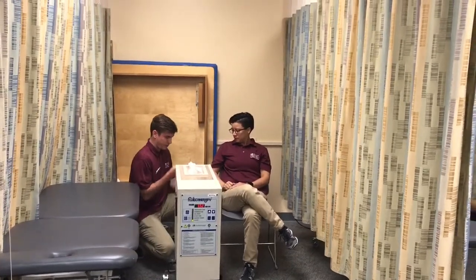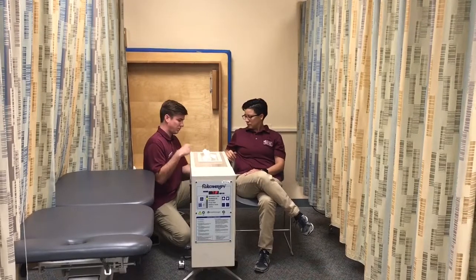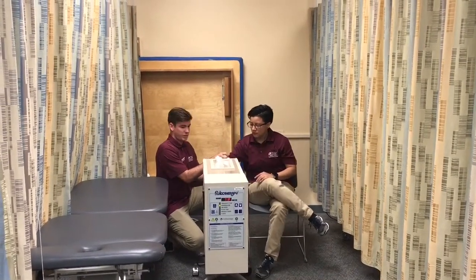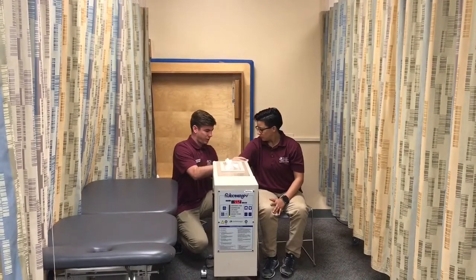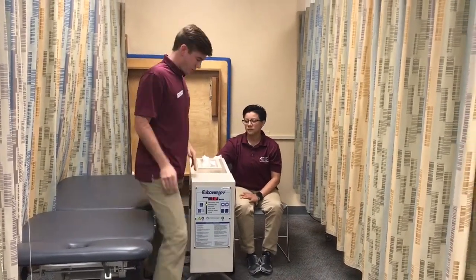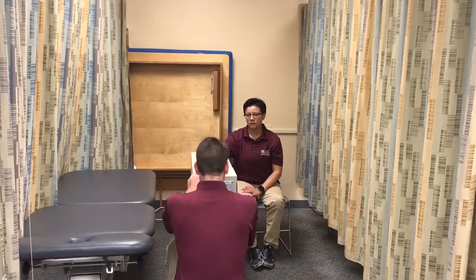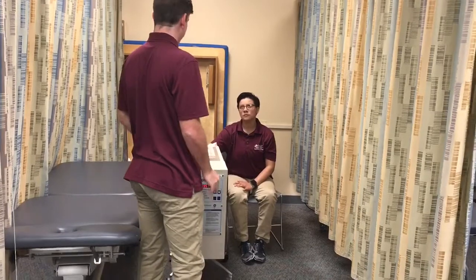Now I'm going to put your hand inside the sleeve and place it in the machine. Make sure it's tight so some of the particles don't fly out. I'll turn the machine on. I'll be back in five minutes, okay?